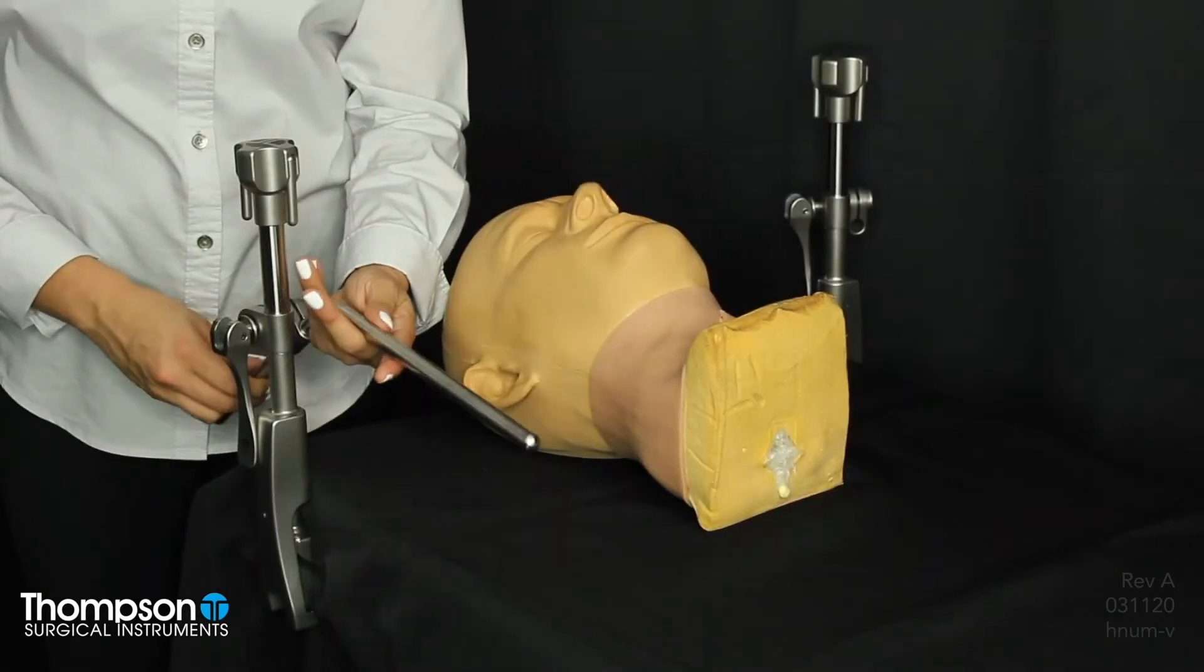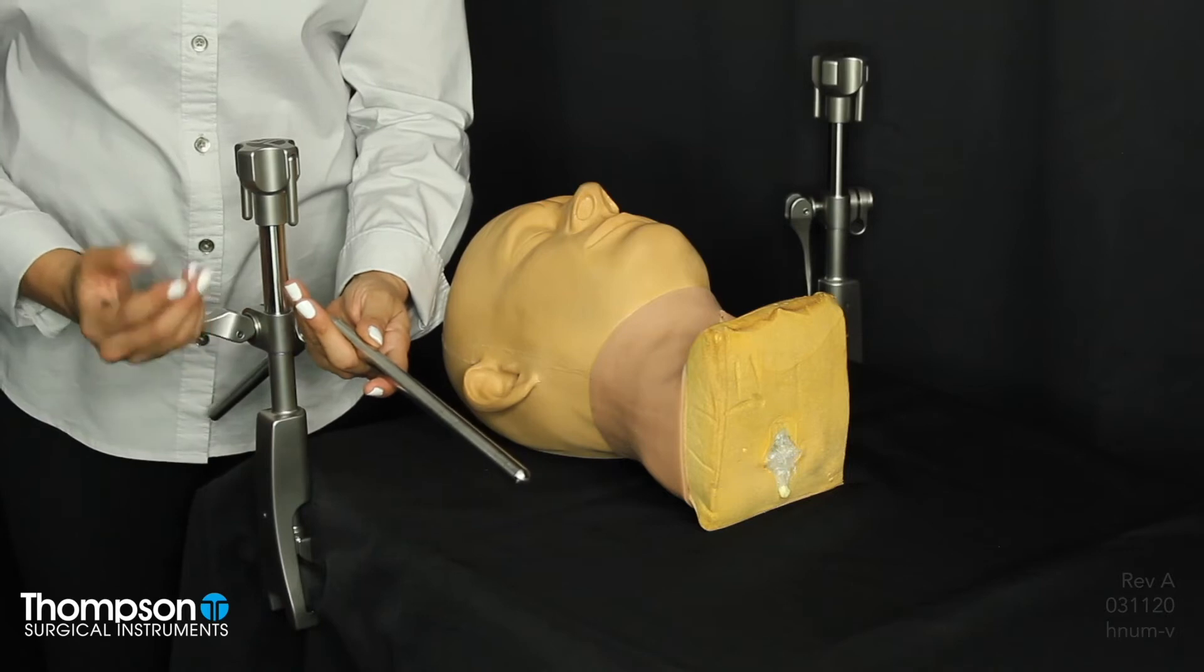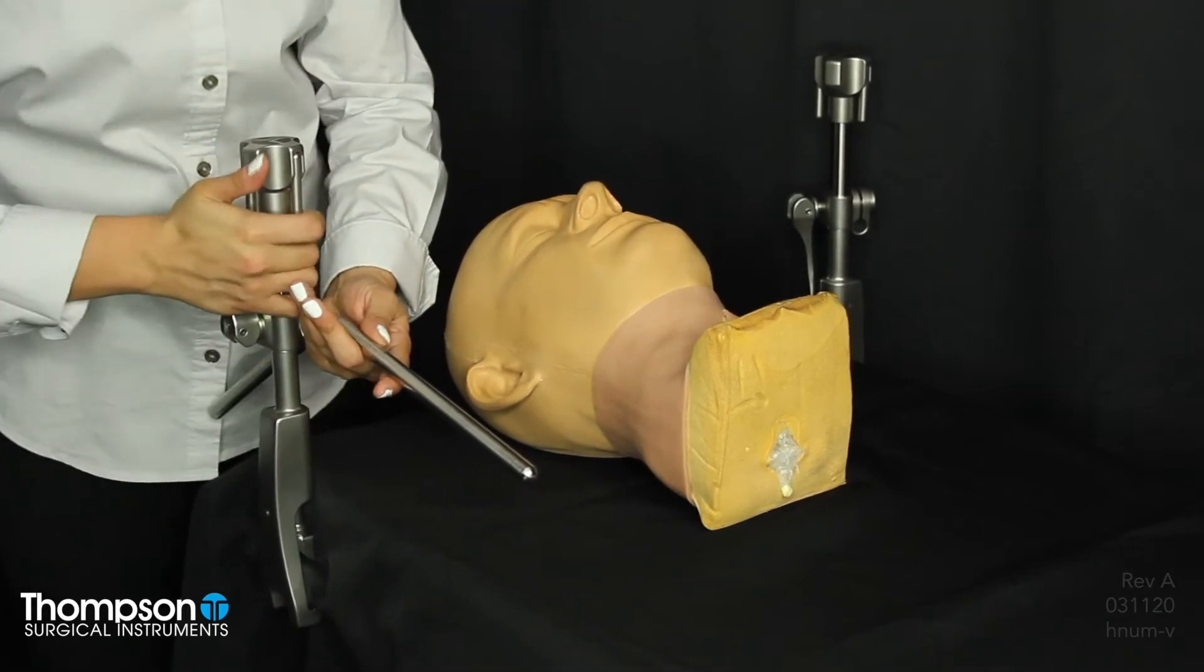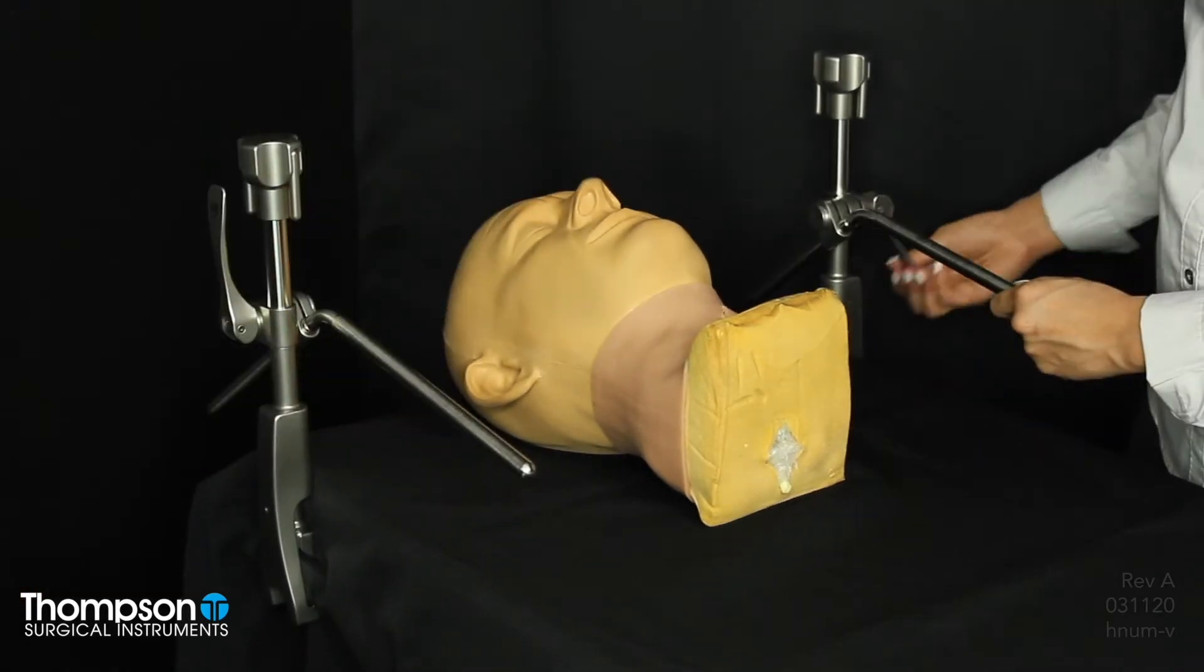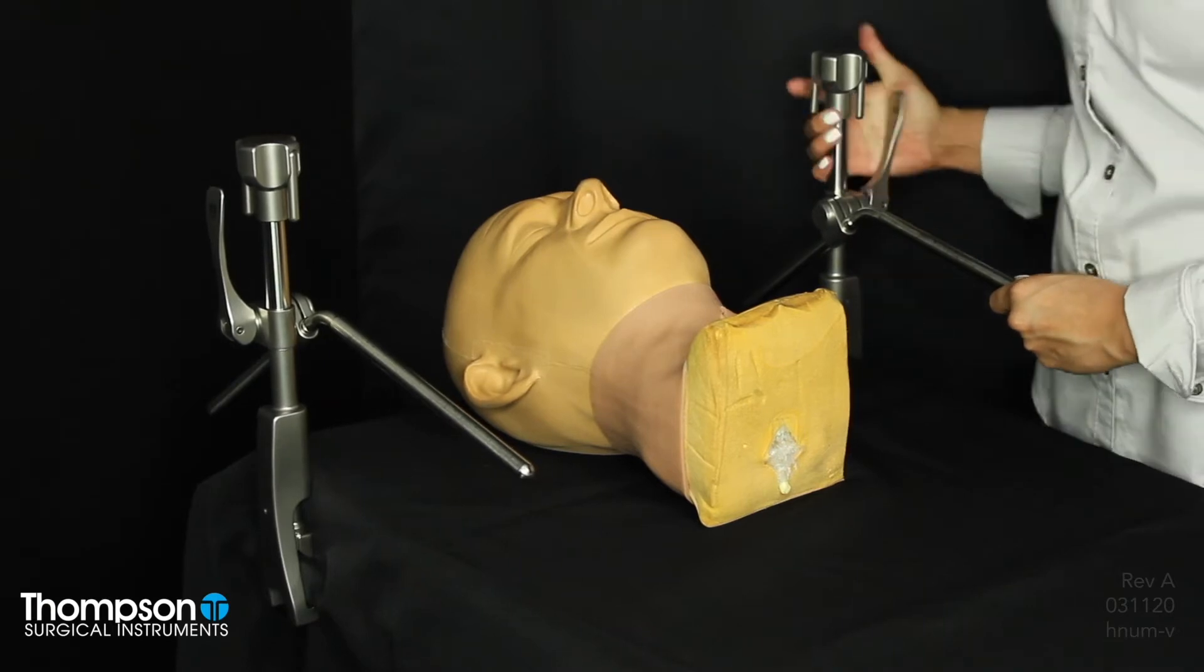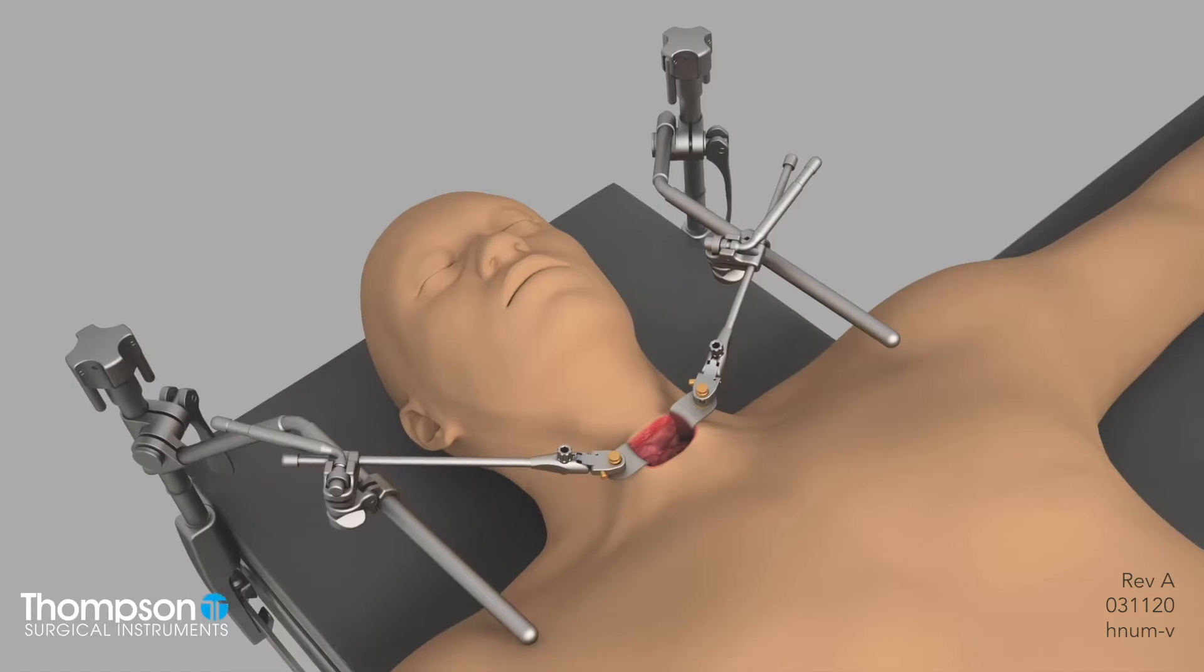Next, insert the lateral arm into the rail clamp's joint. Position low and wide, level with the incision. Repeat this position with the second lateral arm on the opposite side of the table.